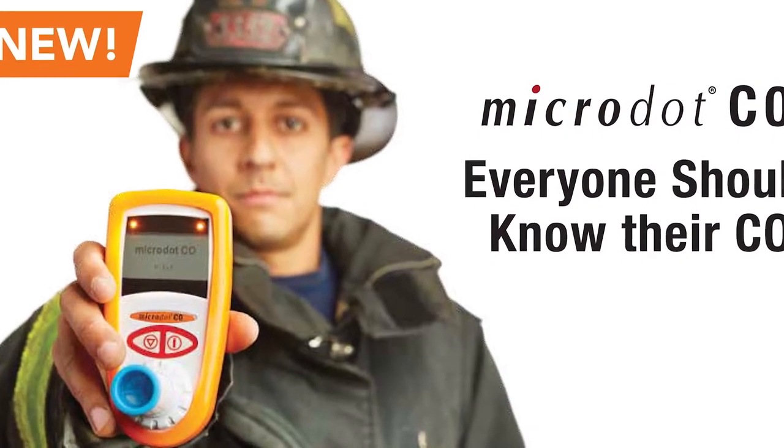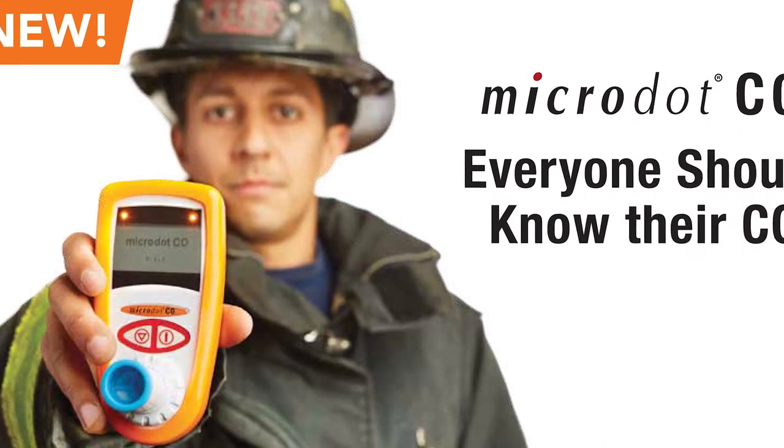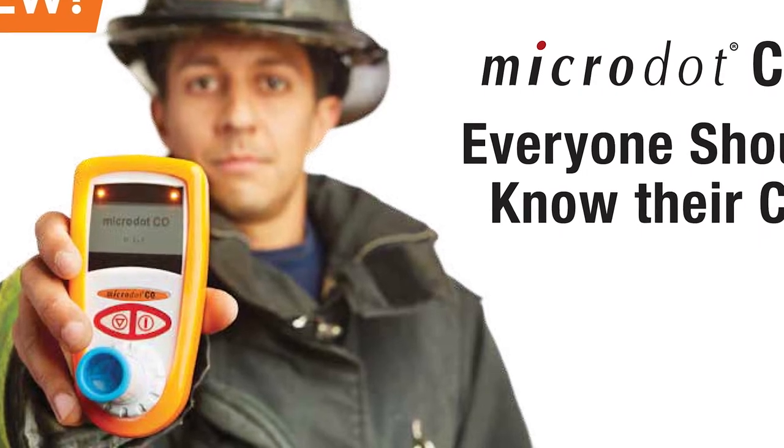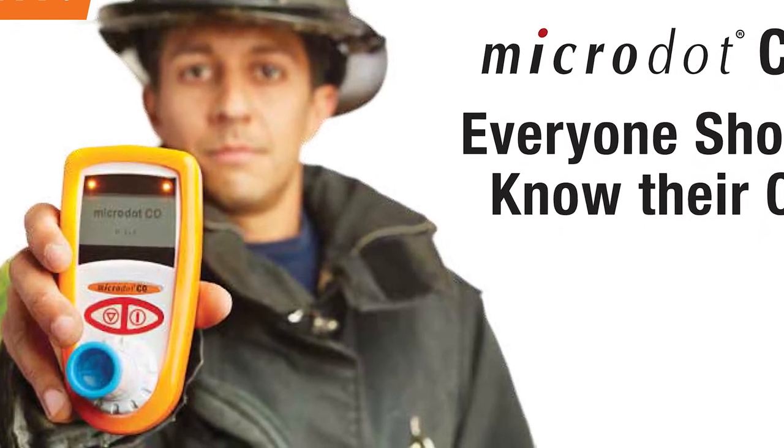Its configurable breath hold time goes from 0 to 20 seconds in increments of 5. Its configurable light indicator is dependent on operator preference. And finally, semi-annual calibration.